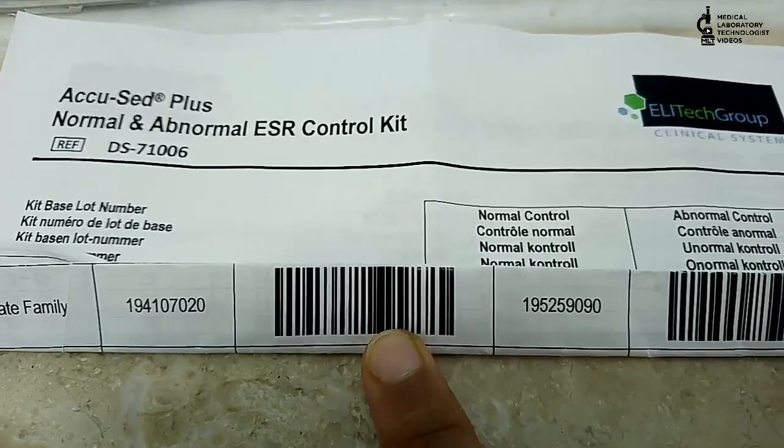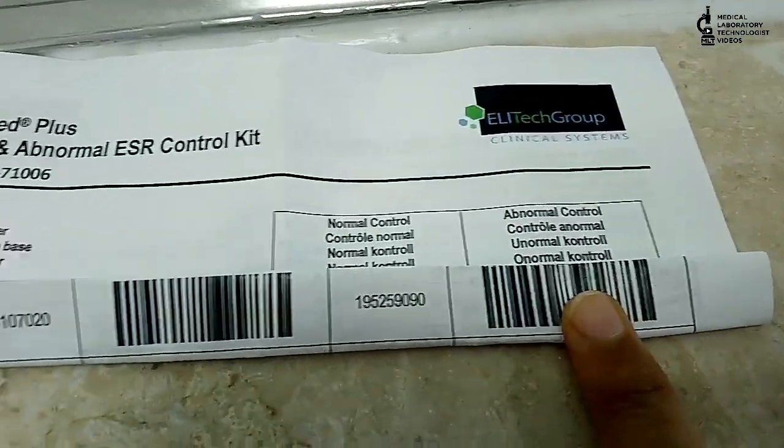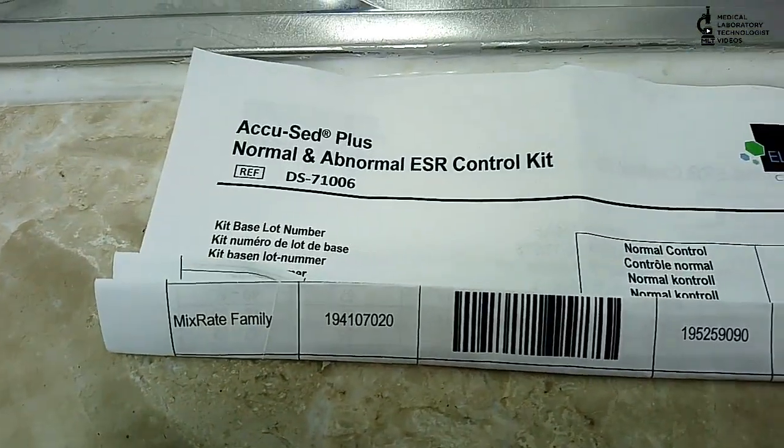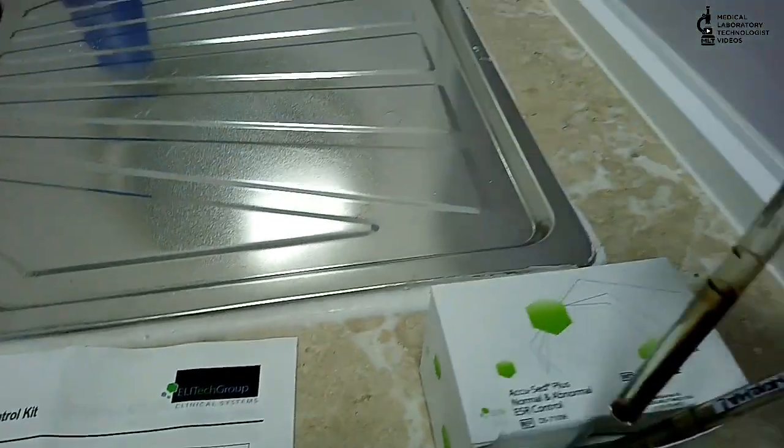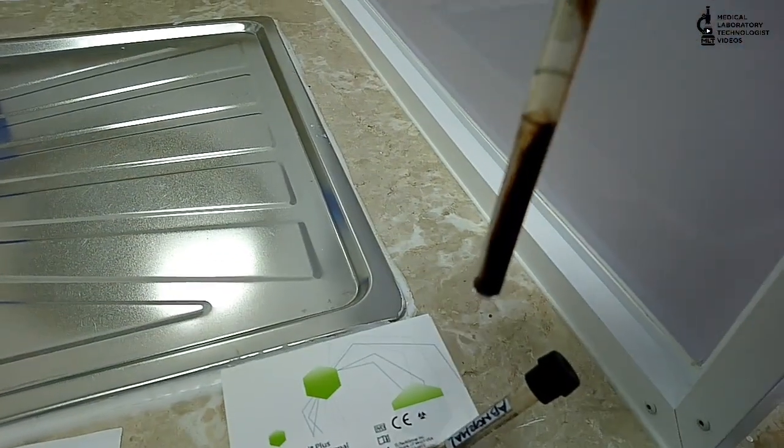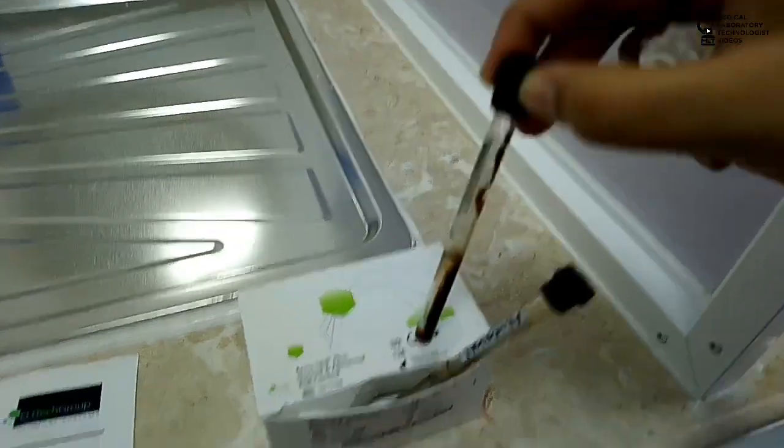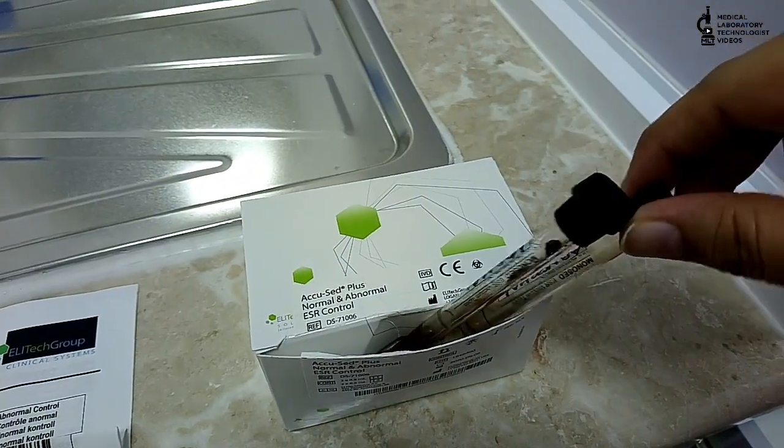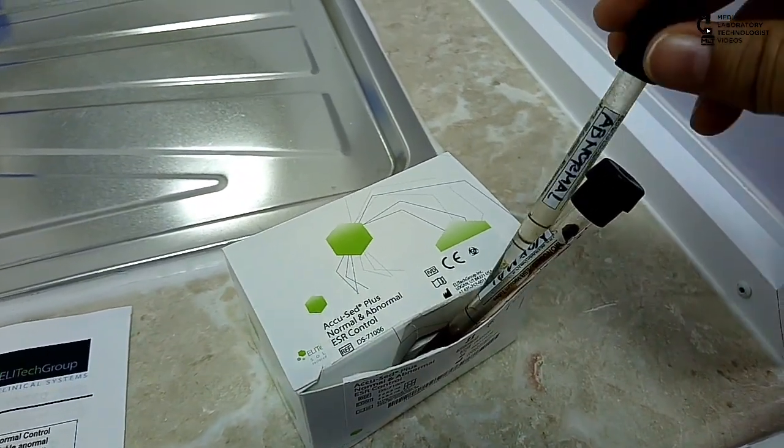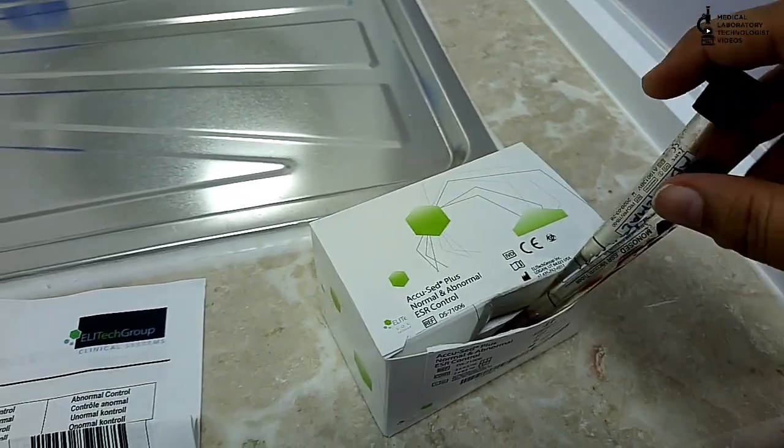There is barcode reading for this control. First you have to enter manually all the values and this barcode number, and after that you can just read your barcode in the machine and run the control. But before running control, you have to mix properly.